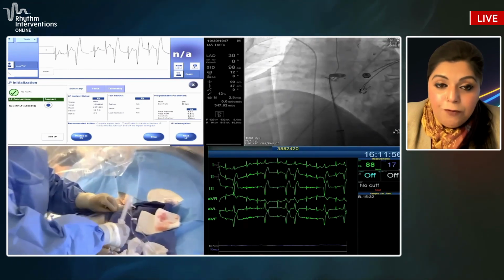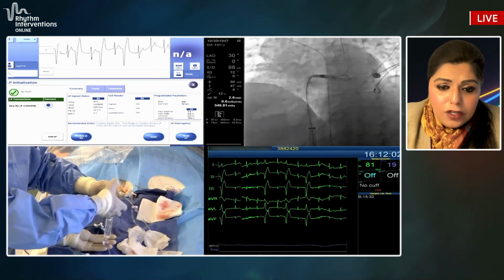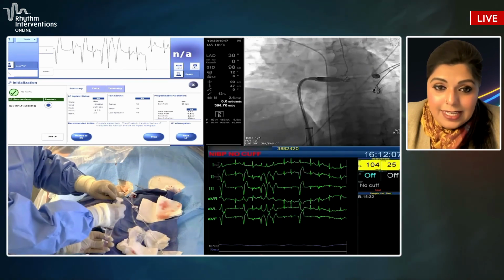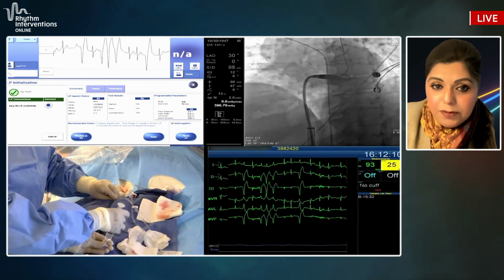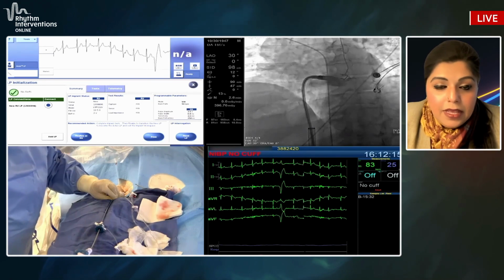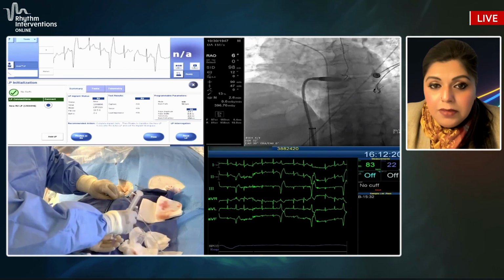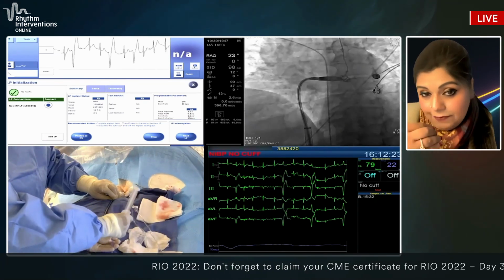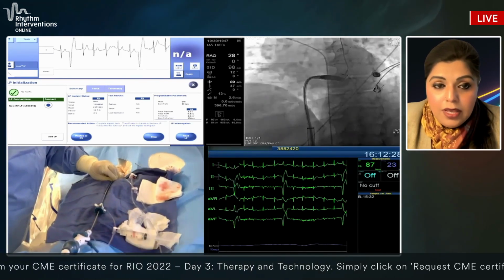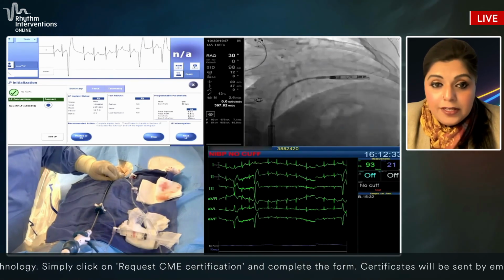You can see I'm not putting any forward force on it, so you really don't need any forward force. I'll give a contrast shot. You'll actually inject it through the port that has a protective sleeve. And you can see I'm not at the apex, but I'm at the low septum there, looking towards apical septum there. And I'll bring it back into RAO now and confirm that I'm actually in the low septum. The LAO really shows you that I'm facing septally. The RAO is what's going to show me that I'm really in the lower septum. So again, I kind of stick to RAO 30, LAO 30 for this implant.